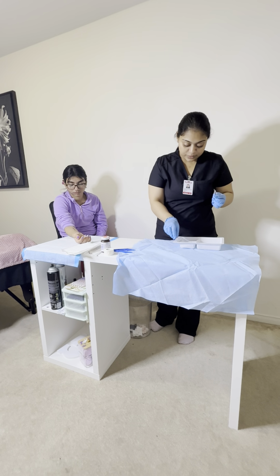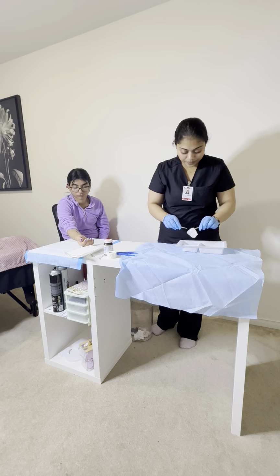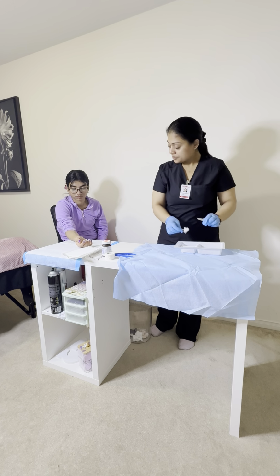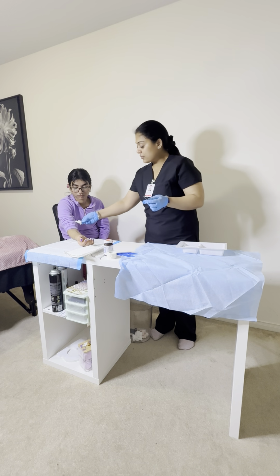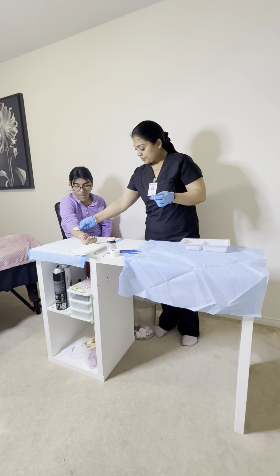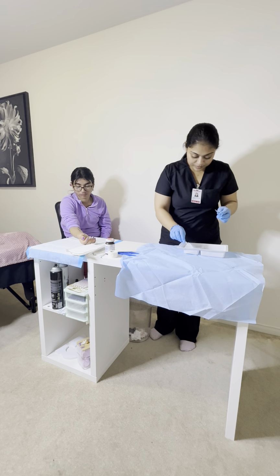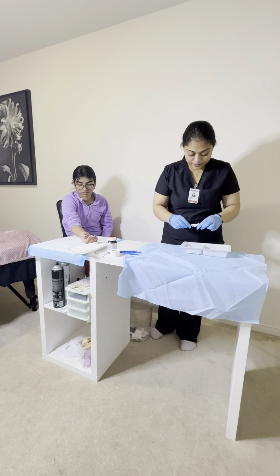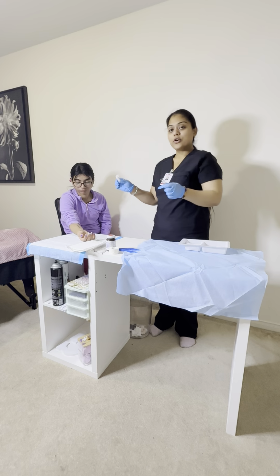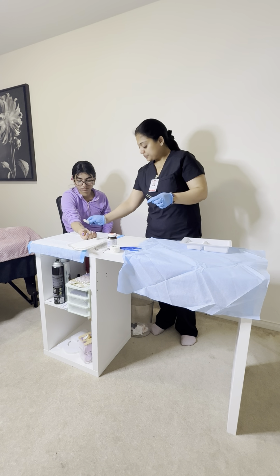I'm going to take another one. Dipping it, squeezing. Now going to clean the farther area from top to bottom. Putting it in the dustbin. Again taking another one. Dipping, squeezing. Going to clean the nearer area of the wound from top to bottom.